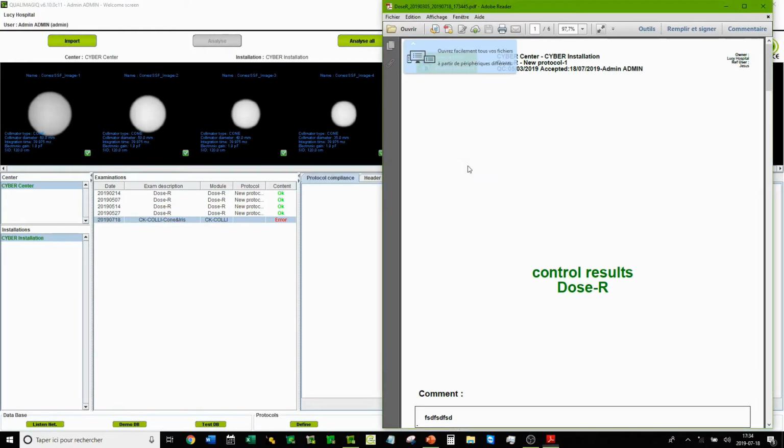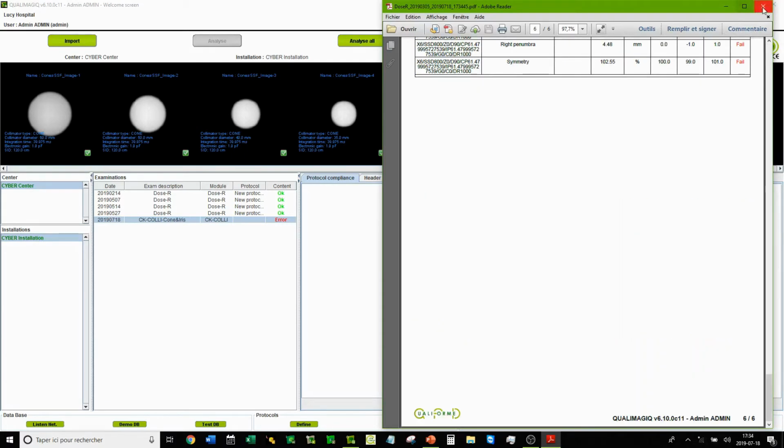Naturally, the most complete report is open for review. If we now return to my PowerPoint presentation.